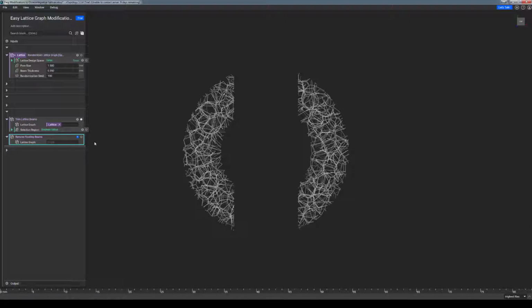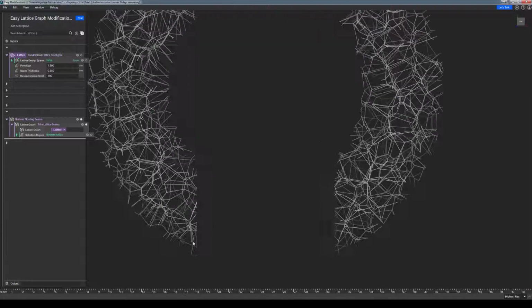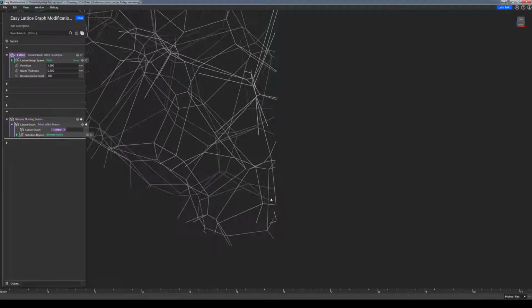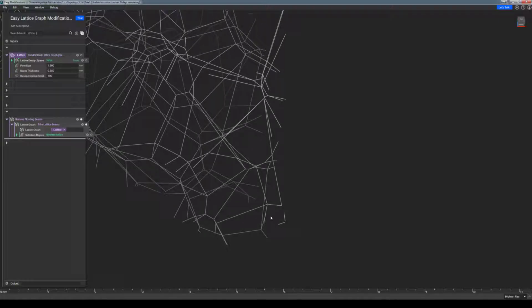Much like the Remove Open Beams custom block, this Remove Floating Beams simply checks the entire lattice graph for beams that are not connected to anything on either side. So for these two beams down here, they are removed as a result of this block, because not only are they floating relative to the main lattice structure, they are actually disconnected relative to each other.